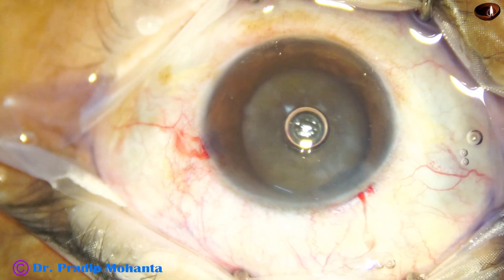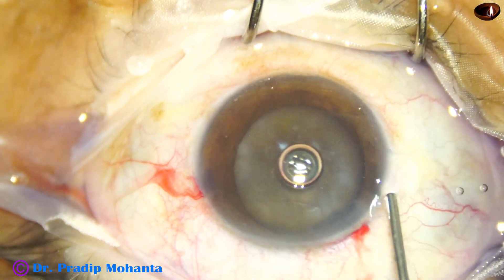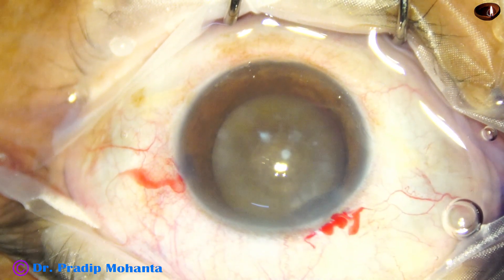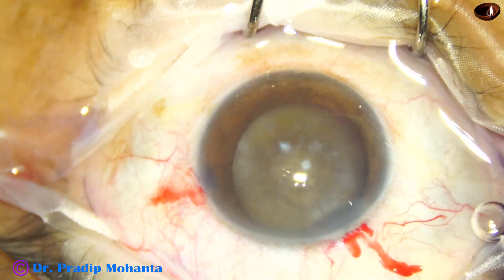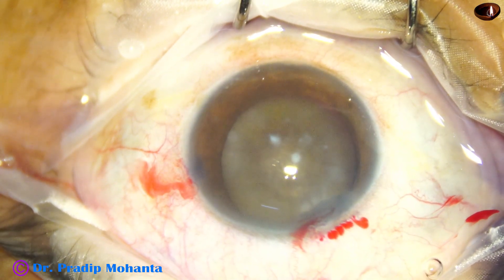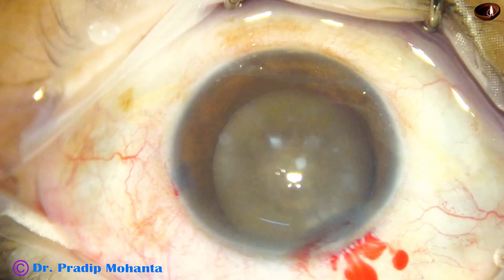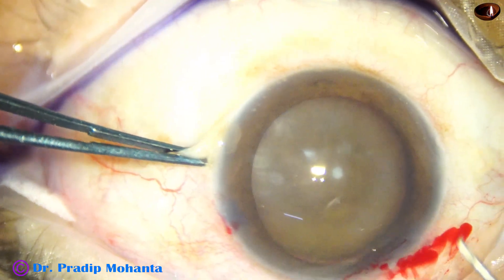Capsulorrhexis is to be done. The anterior chamber is filled up with viscoelastic substance — this is 2% hydroxypropylmethylcellulose. In some cases of this kind of hypermature morgagnian cataract, the zonule is so weak that capsulorrhexis becomes almost impossible, and zonular tear can happen. We may have to sacrifice the bag, or do ICCE and place an iris-supported intraocular lens.